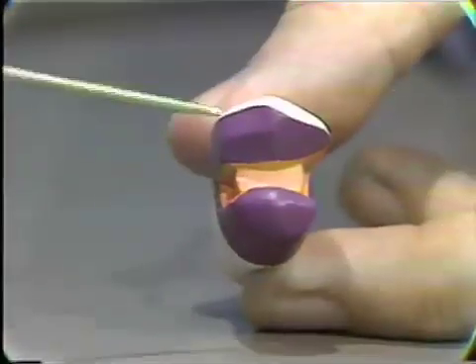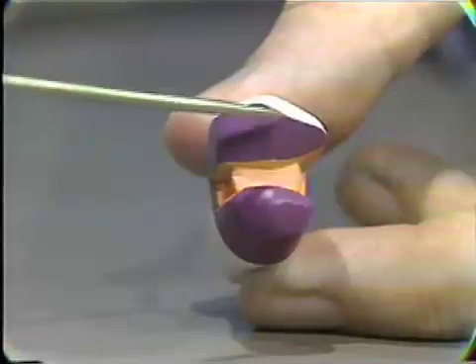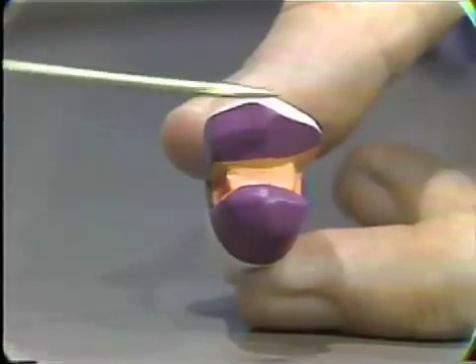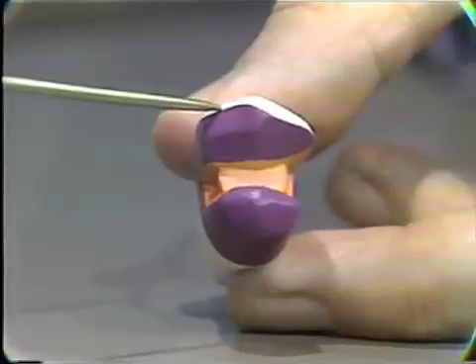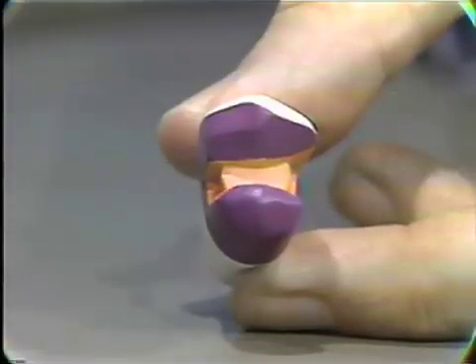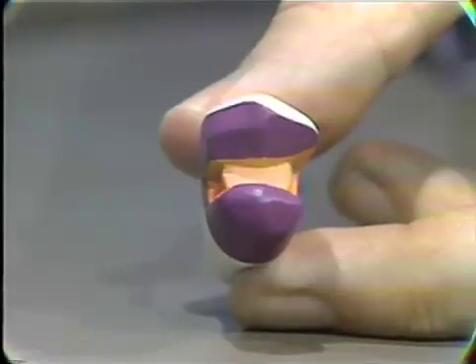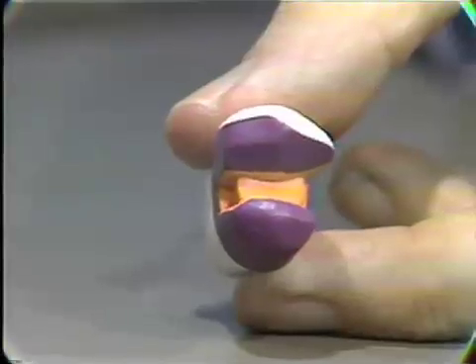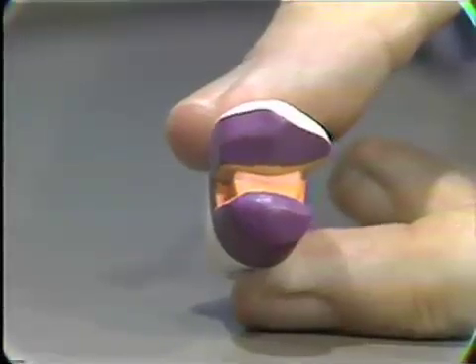Another thing which is done in this particular preparation, I think you can see, is that the degree of occlusal protection of the buccal cusp varies. It's maximum here on the distal of the tooth. It's minimal here on the mesial surface. So that, again, this serves to reduce the amount of gold that might be seen in the mouth. So this then is the second type of three-quarter crown on a bicuspid tooth.